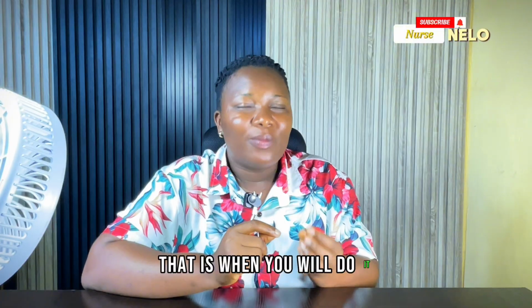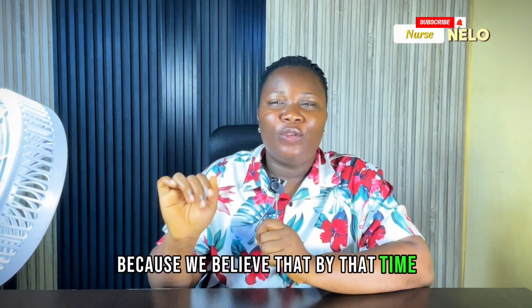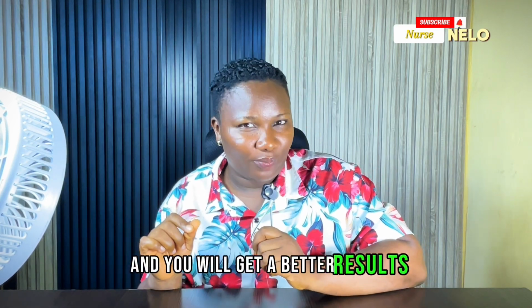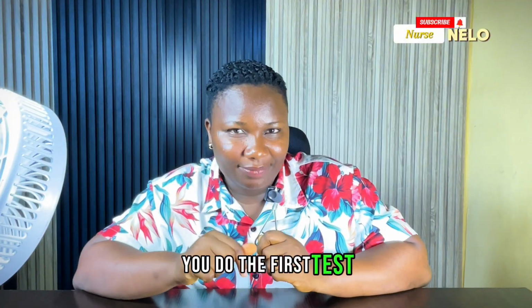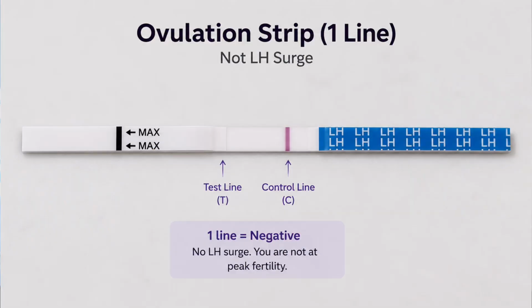That is when you will do it and you will get your result, because we believe that by that time, your luteinizing hormone will be higher and you will get a better result. Do you understand me? So by noon, you do the first test. If your cycle is 28 days, on that 10th day, you might get a negative result.